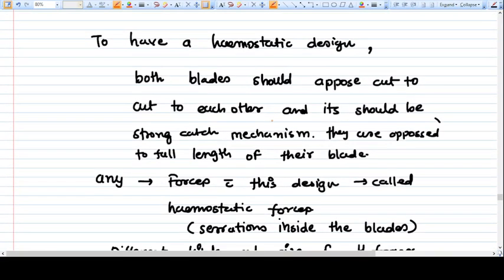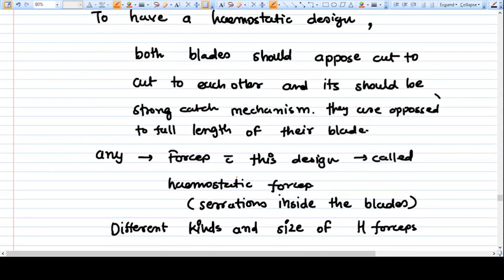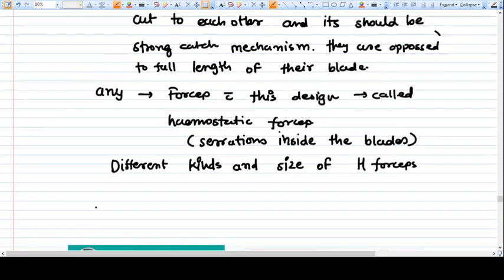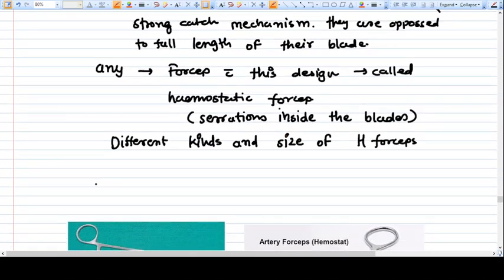So to have a hemostatic design, both blades should oppose cut to cut to each other and should have a strong catch mechanism. That's why they are opposed to each other with the full length of their blade. This design is called hemostatic forceps design, and it is common in every hemostatic forceps you get.